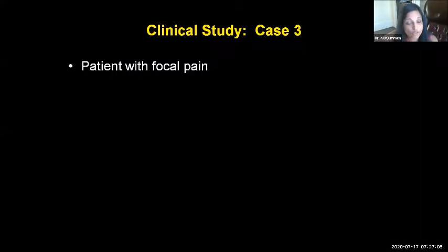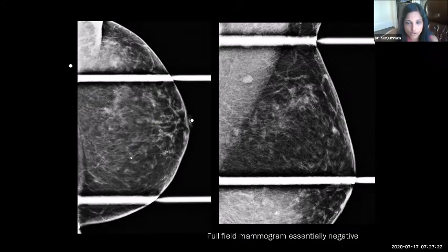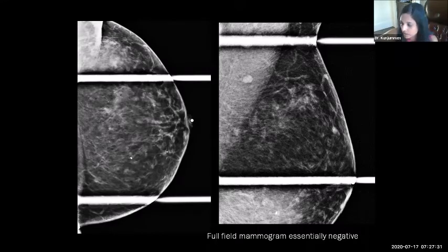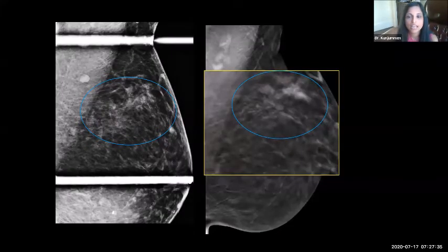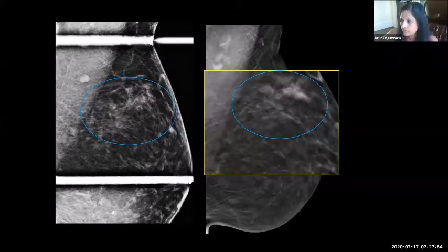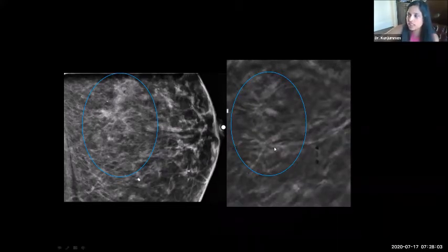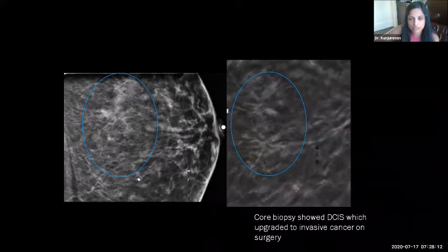This is an example of tomosynthesis in a diagnostic setting. The patient presents with focal pain. At our institution, we do a spot compression image of that area. The full field digital mammogram is essentially negative at the area of focal pain around 12 o'clock. However, on the tomosynthesis slide, there is a distortion at the area of focal pain not seen on the 2D mammogram. On the CC view, you can also see the distortion much better on tomosynthesis. The core biopsy showed DCIS, which was upgraded to invasive cancer at surgery.